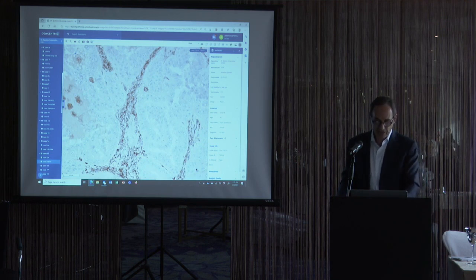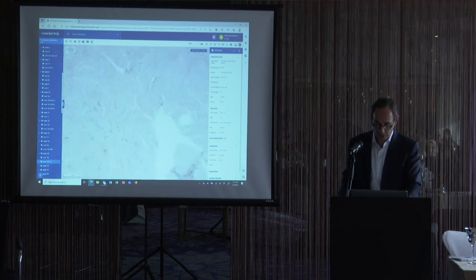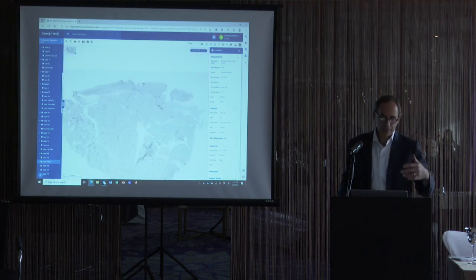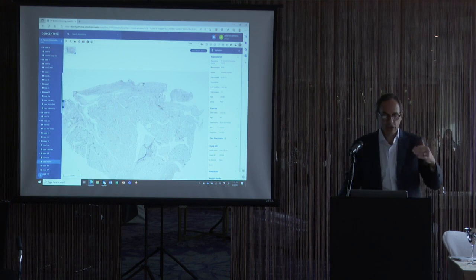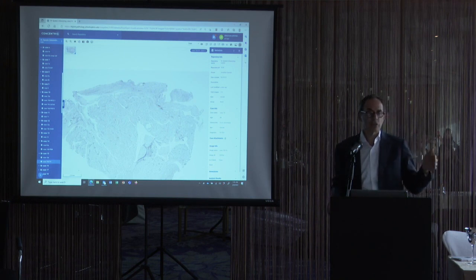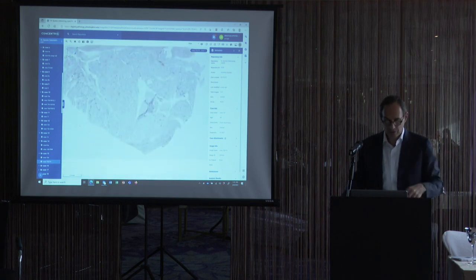So this is an FH deficient RCC arising in association with a tubulocystic carcinoma, and we would basically say in our note, this could be associated with hereditary leiomyomatosis-associated RCC, HLRCC, but it could also be sporadic, and then it's up to the clinician to do genetic testing, see if the patient has, if it's a female, leiomyomas, and assess the patient for potential germline mutations.